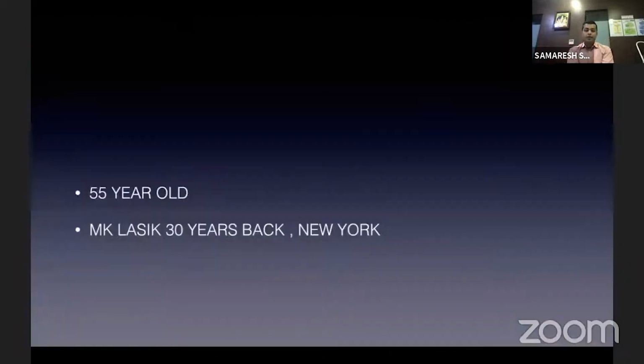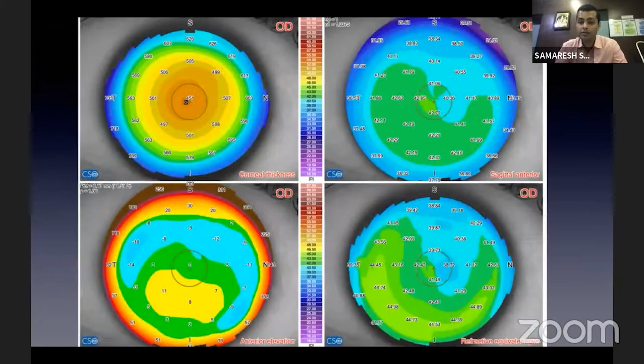This is another patient, 55 years old, and has had LASIK 30 years back, probably a microkeratome because she was operated in New York, because I think that was a fad then to go and operate over there. And this is how the cornea looks.